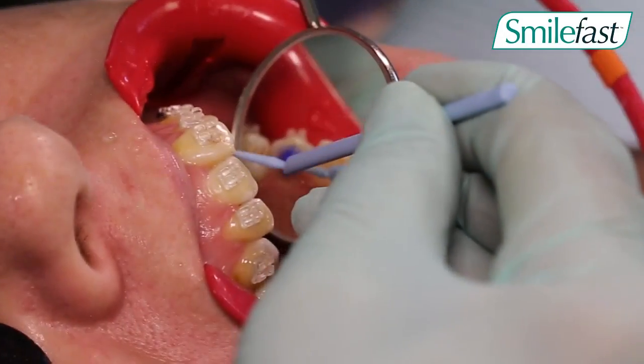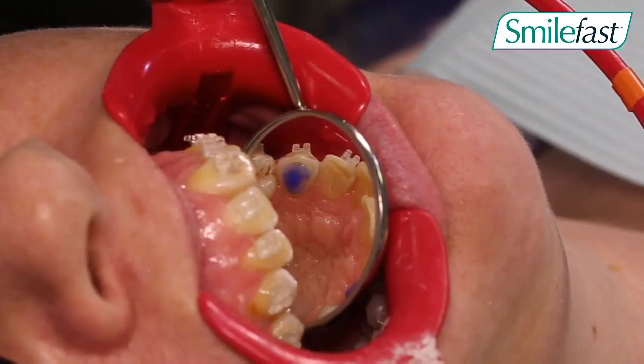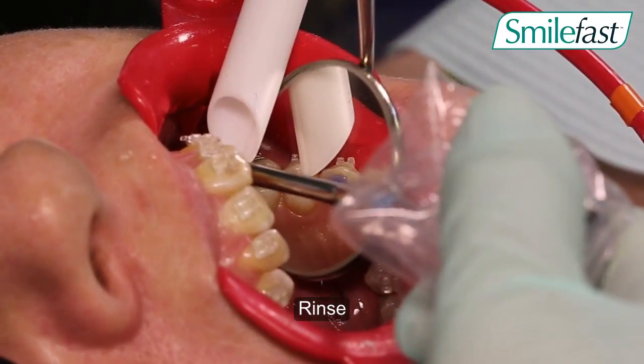Placement of the bite turbos obviously requires cheek retractors. You initially etch the teeth that will have the bite turbos placed on them.